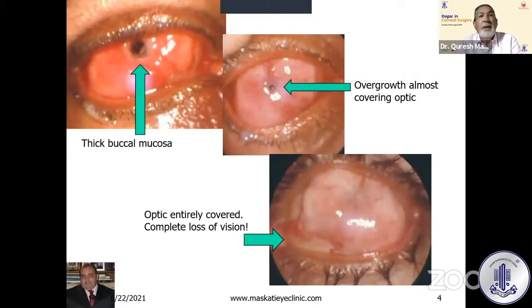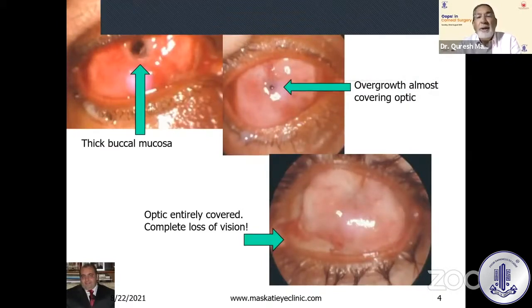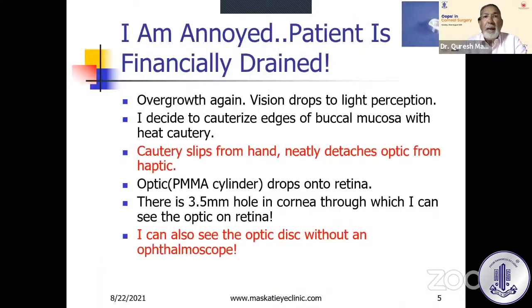This is the thick buccal mucosa that you can see — it's overgrowing. You can see a pinhole effect in the middle, and then the optic completely covered with complete loss of vision, going from 6/18 to perception of light. I was annoyed because the patient was financially drained. So I decided to cauterize the edges of the buccal mucosa after cutting it off with a heat cautery — my father's heat cautery, those which you heat in a spirit lamp.